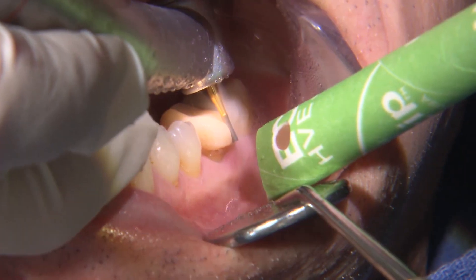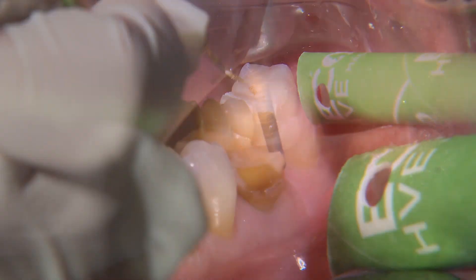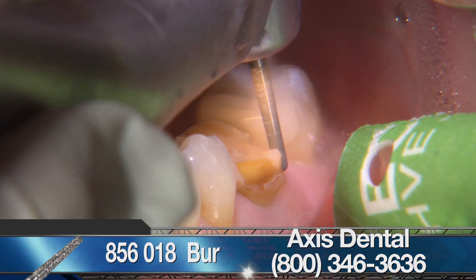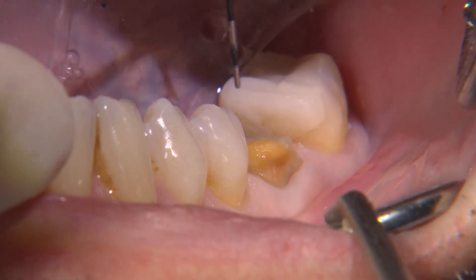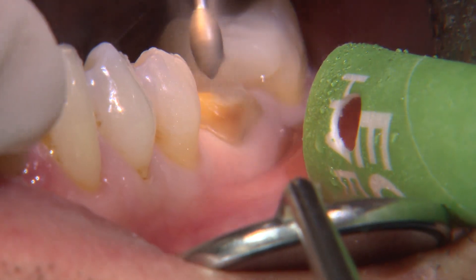I began the removal with a 557 carbide. I then refined the prep with a coarse grit round-ended tapered diamond, 850-018, on the axial surfaces to create a chamfered margin that's positioned equigingivally. I traced the margins with the probe to confirm there is an apical stop and that it's smooth circumferentially.